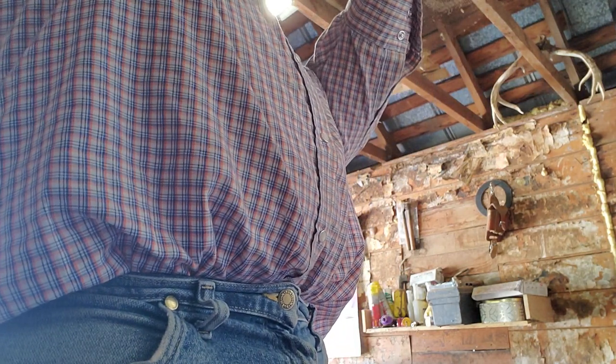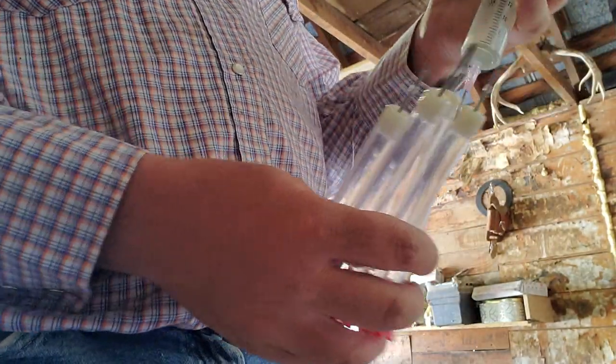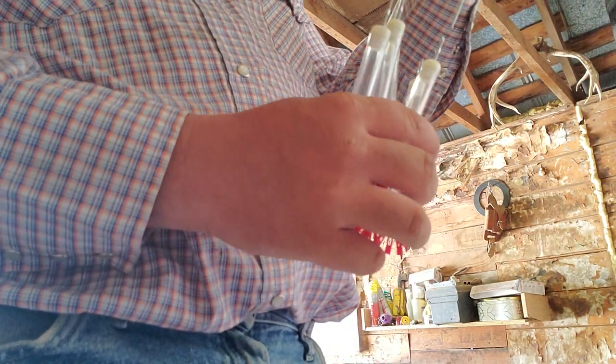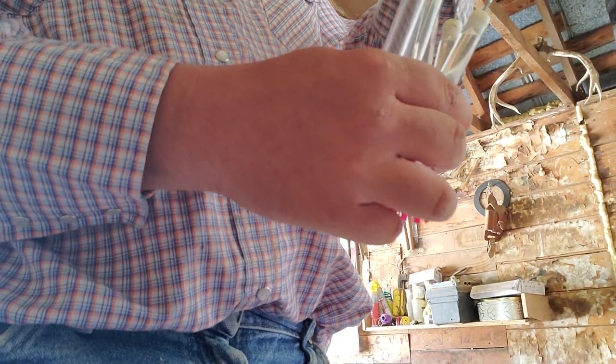A lot of times Baytril is a good drug, but the problem is that the single-day dose is a very large volume. So you've got to hit them right — if you need to doctor that calf knowing you're going to have to come back anyway, you can hit those calves with a 10cc syringe. Baytril does work in these darts, actually works really well, but you've got to run a bigger syringe.